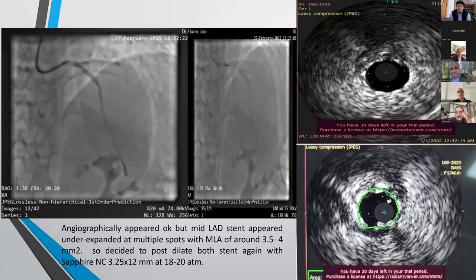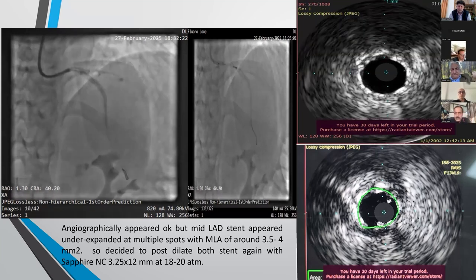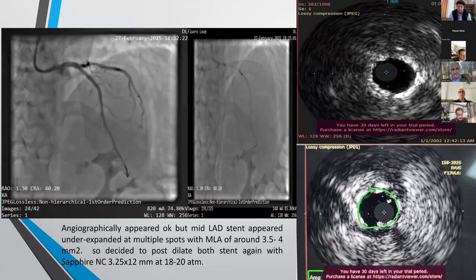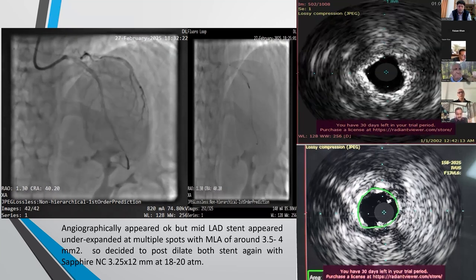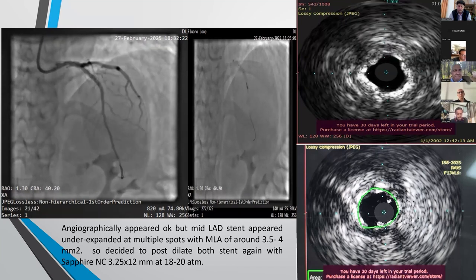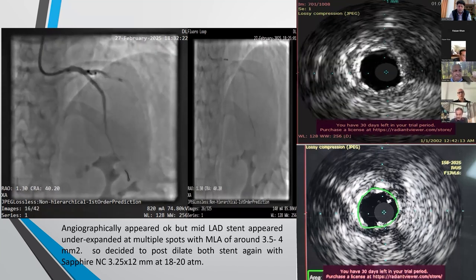I don't know about others. GP, we reuse the FFR wire 3 times, and then the cost is reduced. The patient is told this is a reused wire, so the cost would be 1/3. If it's new, then it's whatever the new cost is.